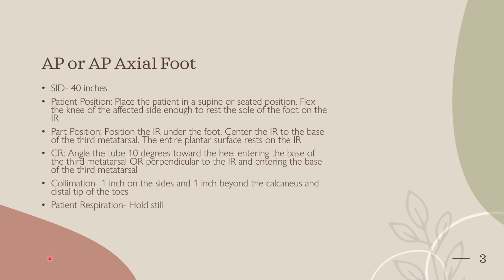The CR: angle the tube 10 degrees toward the heel, entering the base of the third metatarsal, or perpendicular to the IR and entering the base of the third metatarsal. The collimation is 1 inch on all sides and 1 inch beyond the calcaneus and distal tip of the toes. Patient respiration is to hold still.